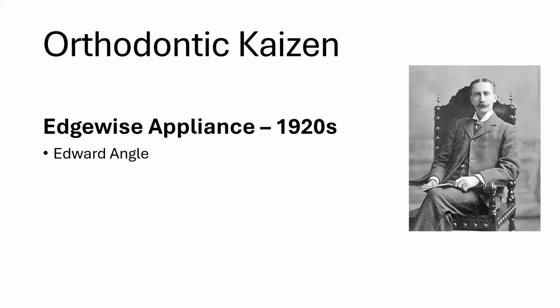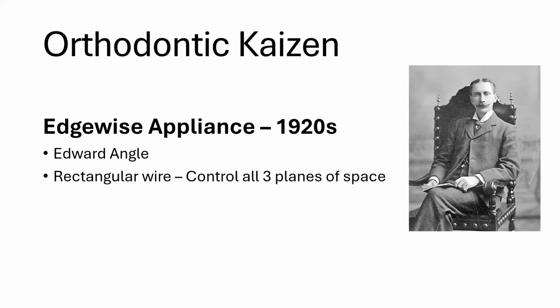100 years ago, Edward Angle, back in 1925, he released the Edgewise appliance. And that was the first appliance that we had control of a tooth in all three planes of space. And it was just groundbreaking. But not only that, Edward Angle, he was a businessman. He had 46 patents in the United States.